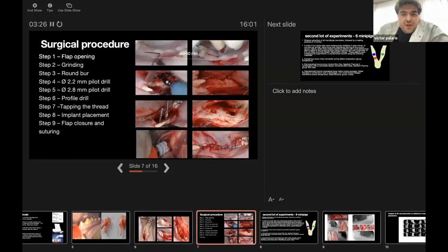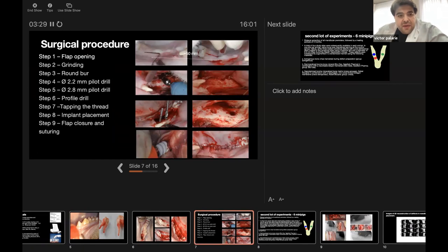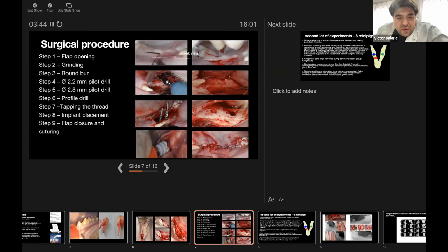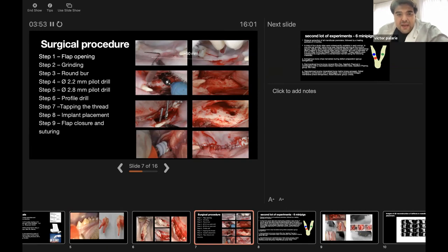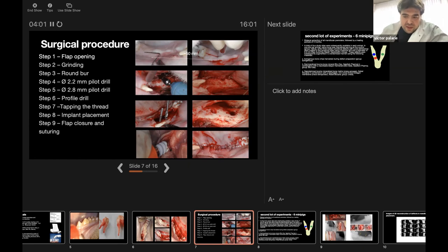The surgical procedure for the implant placement was performed after three months. We did flap opening with mid-crestal incision of the lower jaw and grinding of any reminiscence of the bone. First, we used a round bur and then in sequence we used two drills: 2.2 and 2.8 millimeter pilot drills and finished with the profile drill. Implant placement was made using the surgical motor, and for flap closure we used interrupted resorbable Vicryl sutures number 5-0.